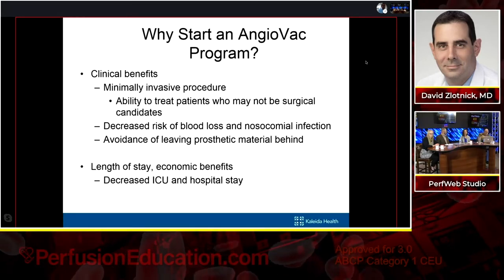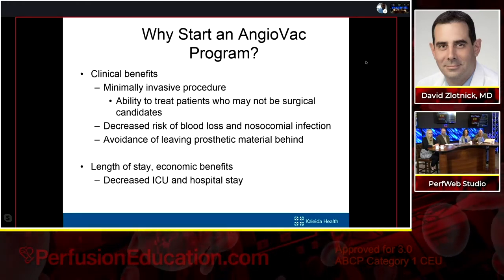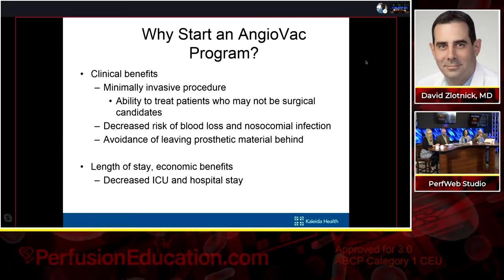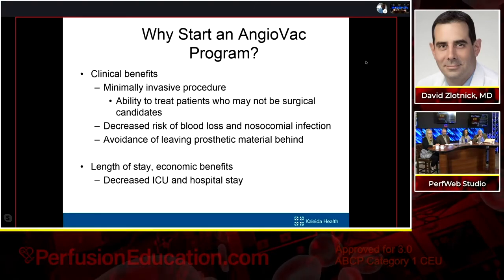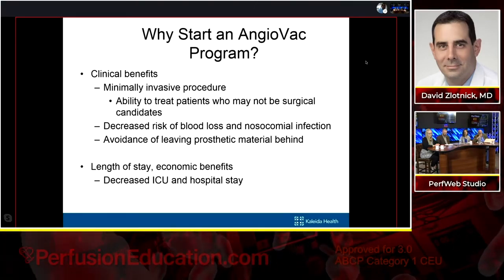We're giving the blood back to the patient, as well as decreasing nosocomial infections. And we want to avoid leaving prosthetic material behind that may become superinfected. There may be economic benefits, such as decreased length of stay in the hospital, as well as decreased ICU and hospital stays.